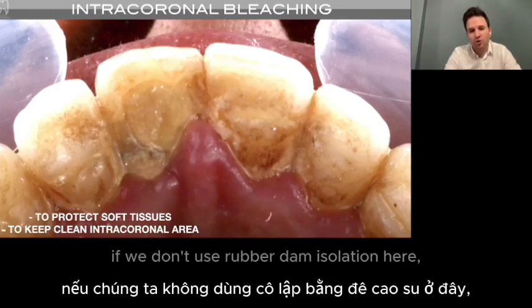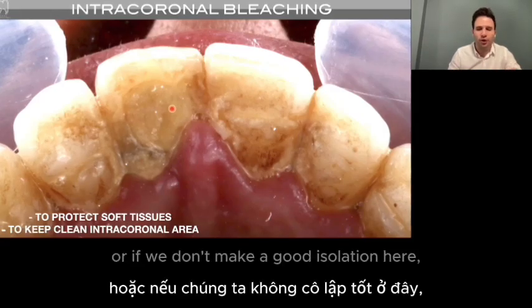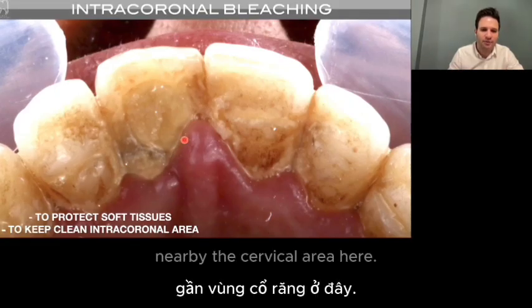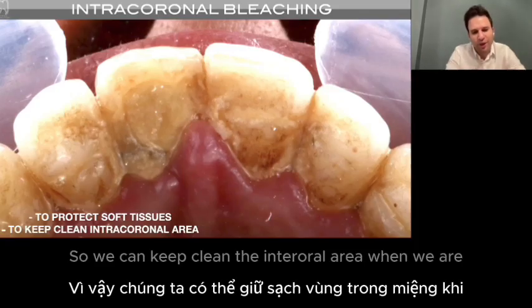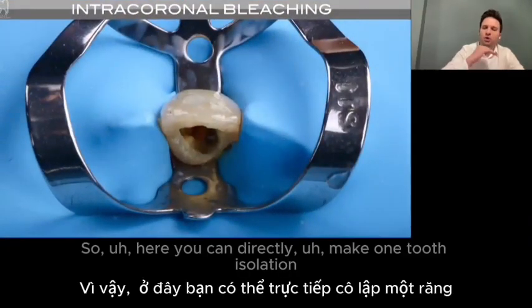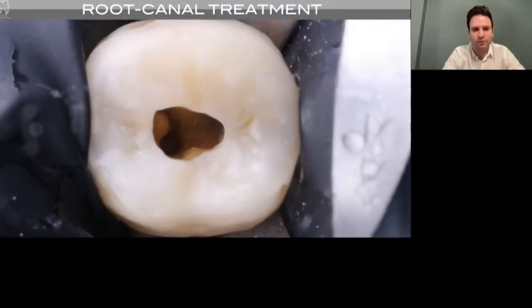If we don't use rubber dam isolation here, or if we don't make a good isolation, there may be some leakage nearby the cervical area. So we can keep the intracoronal area clean when we are doing intracoronal bleaching. Here you can directly make one tooth isolation, and you can continue what you want to do.